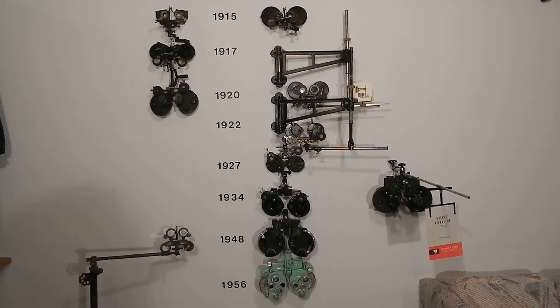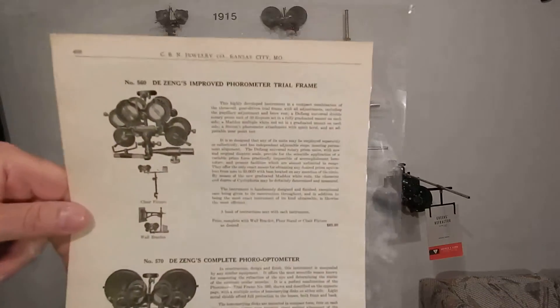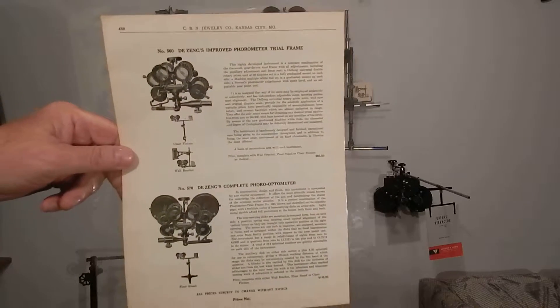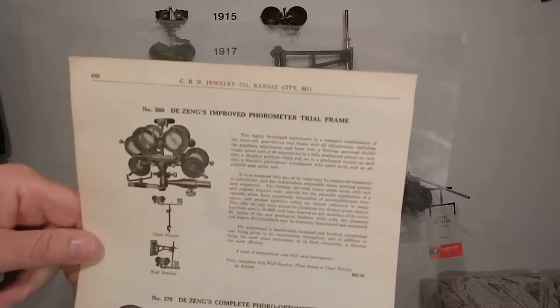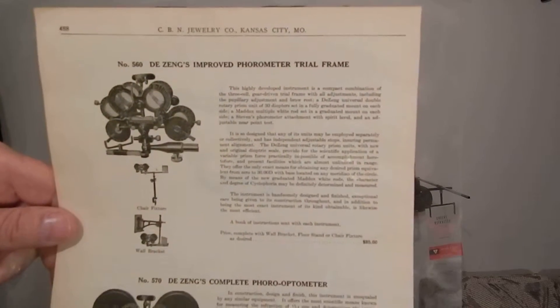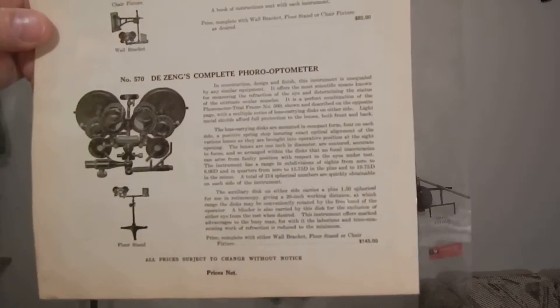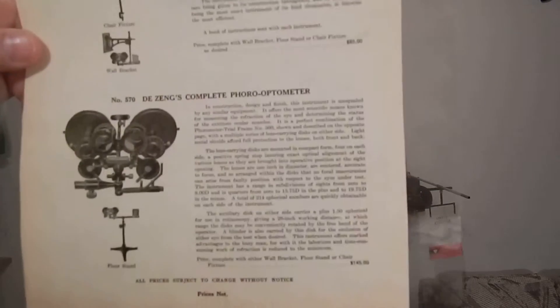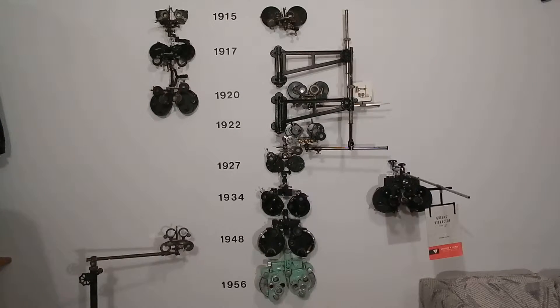The first thing he made that looks like a phoropter is the 570 on top. Here's the 560 advertisement from 1918 from that same jewelry store catalog. There's the 560 down on the floor and the 570, which is the same exact thing only it has an optometer on each side for getting spheres.